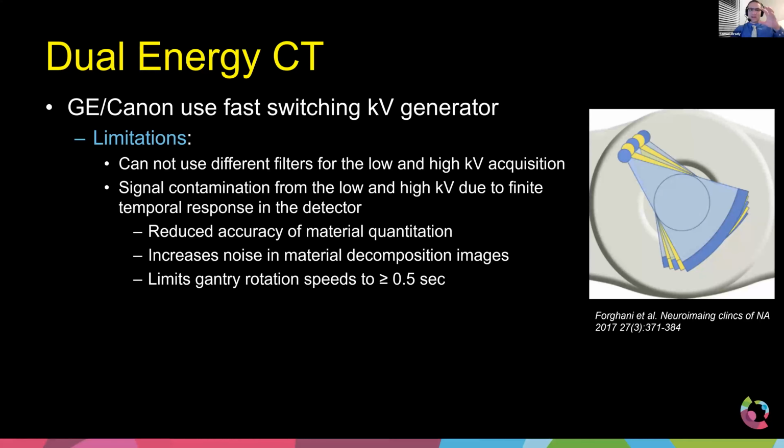So it's going to have some inherent limitations on how many photons it can produce at the low energy and the high energy. And remember, we said that noise is an issue in creating these images, and the noise is most problematic at the low energies. So we'll talk about that more when we get into the dose calculations.